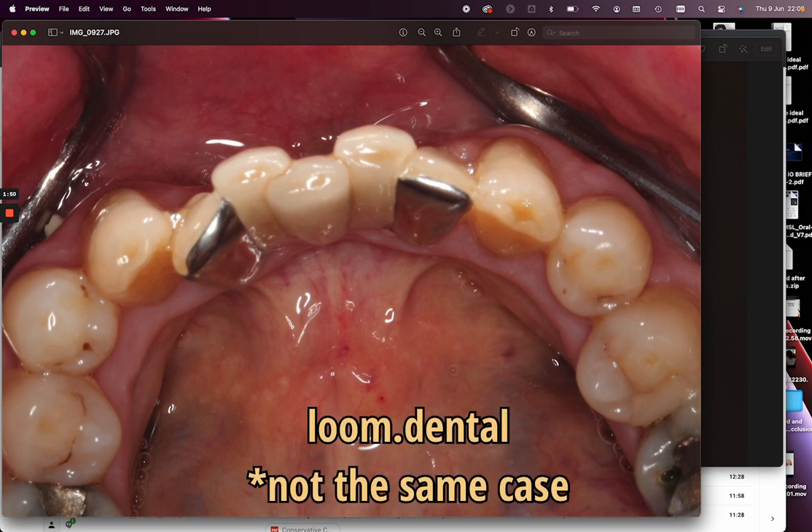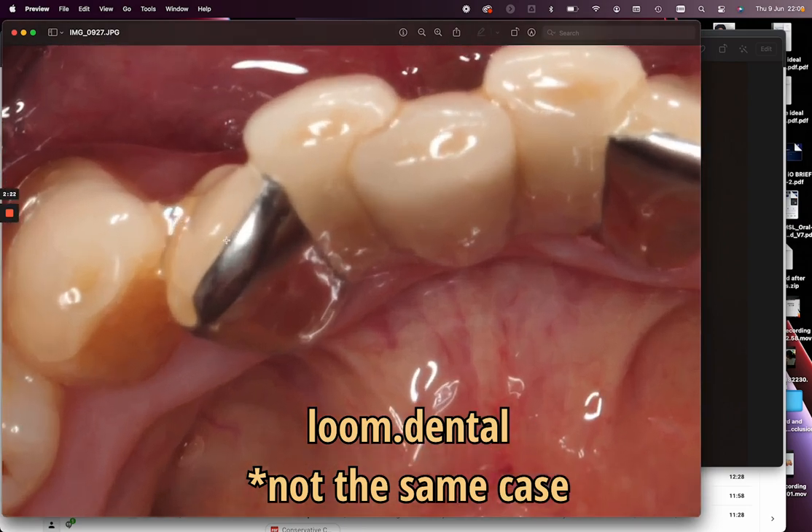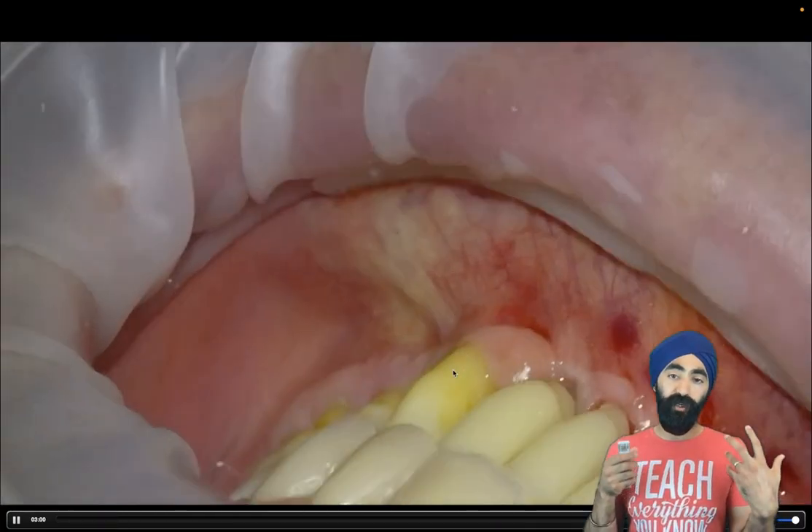And so actually bring it over and cover half to three quarters of the canine. Don't worry about the occlusion — the patient has an upper complete denture, I will adjust the left side which is touching a bit. I need you to cover over the canine with the metal. So it's going to start lingually, go all the way around, and wrap over onto the canine. This will protect the resin bonded bridge cement lute against shear forces. I do believe it's attributed to my success. So here you're going to wrap over to the canines. So now we have the bridge seated passively — I'm ready to cement it.